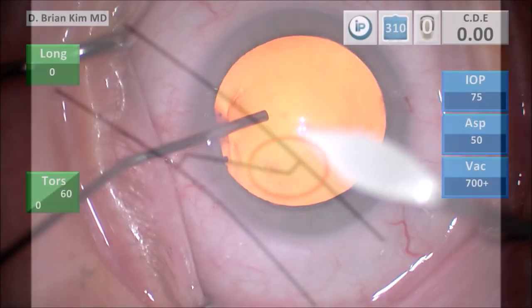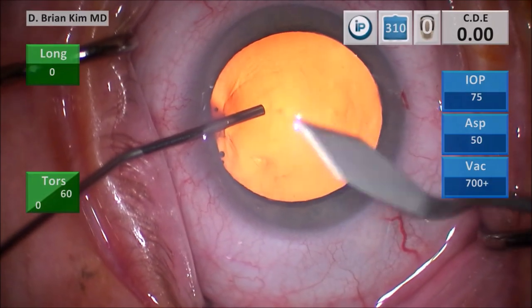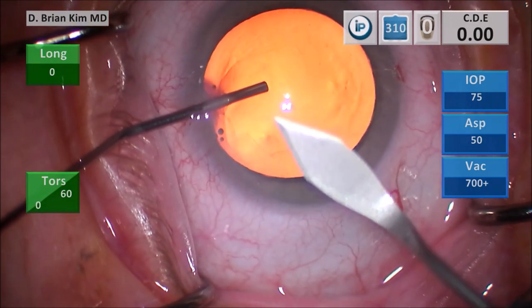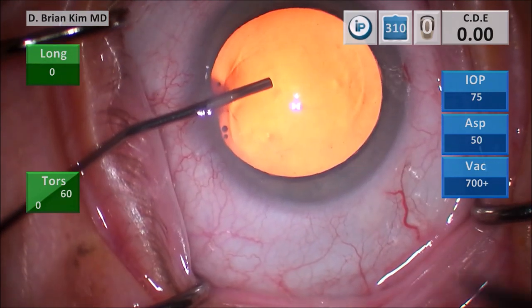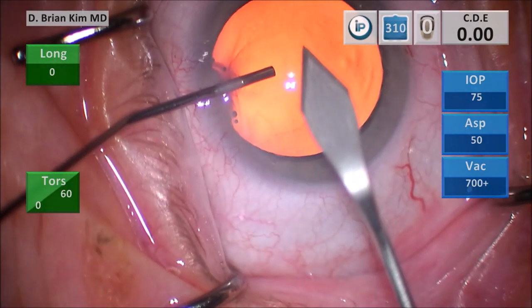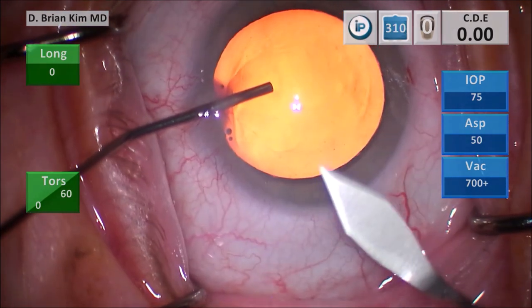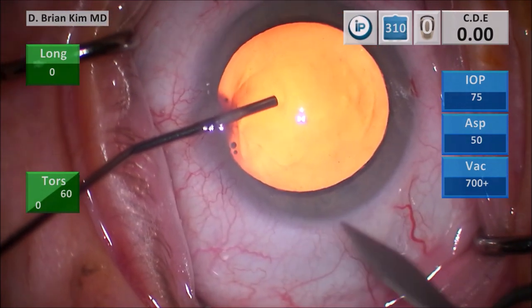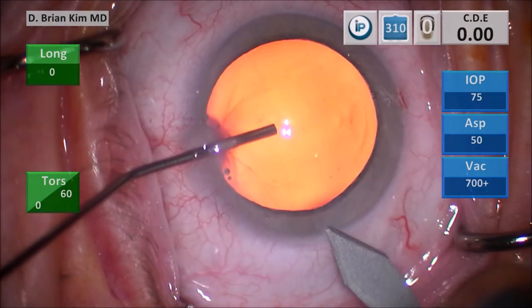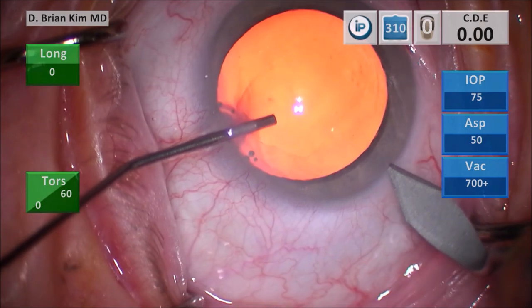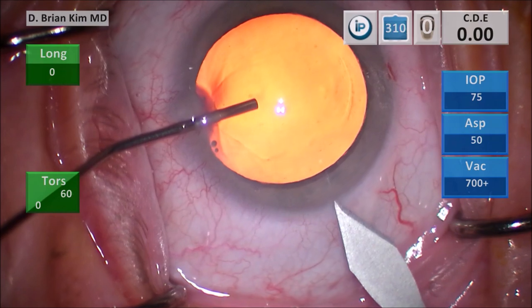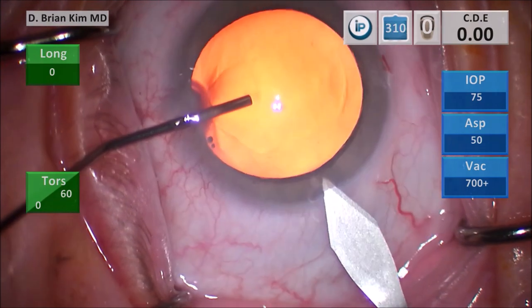So this is a Diametrix Protect Clear Corneal Blade. This is a 2.65 millimeter blade, and it's a non-symmetrical double bevel design. It's a very thin profile blade. I'm going to use this—I'm trialing this for Diametrix for the first time. I'm going to make a vertical groove, but this is a little bit difficult to score with a metal blade. You're not actually going to stab that deeply with the metal blade compared to the diamond blade. So you're just scoring first, but then you push down into the stroma, and as you push into it, then you torque and tilt your blade.